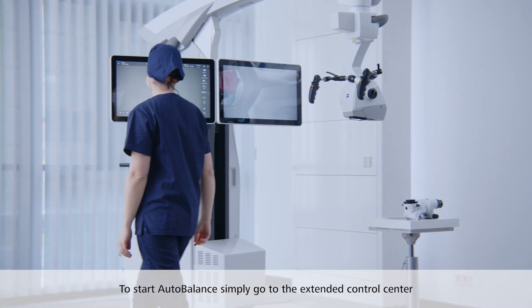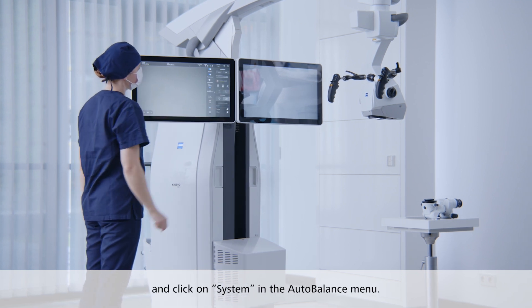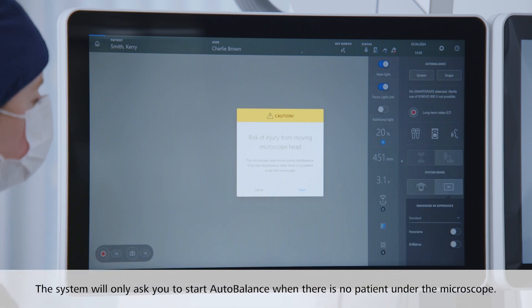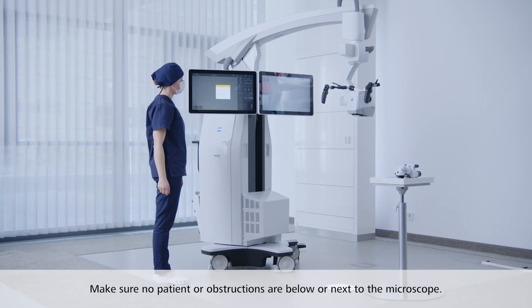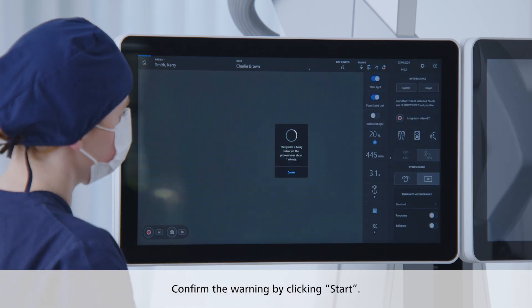To start Auto-Balance, simply go to the Extended Control Centre and click on System in the Auto-Balance menu. The system will only ask you to start Auto-Balance when there is no patient under the microscope. Make sure no patient or obstructions are below or next to the microscope. Confirm the warning by clicking Start.